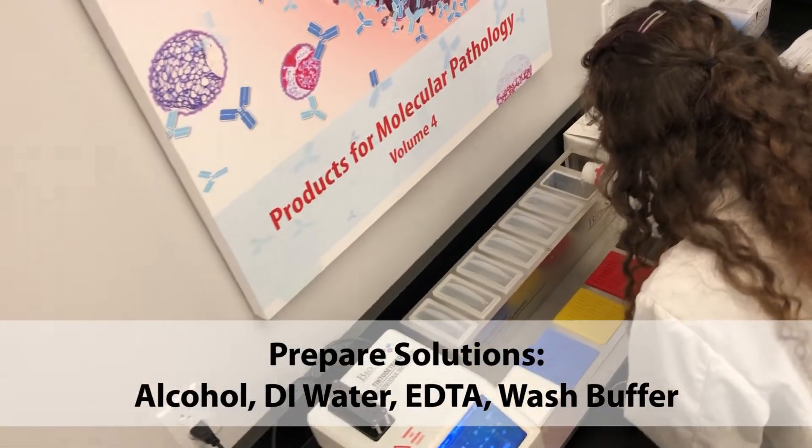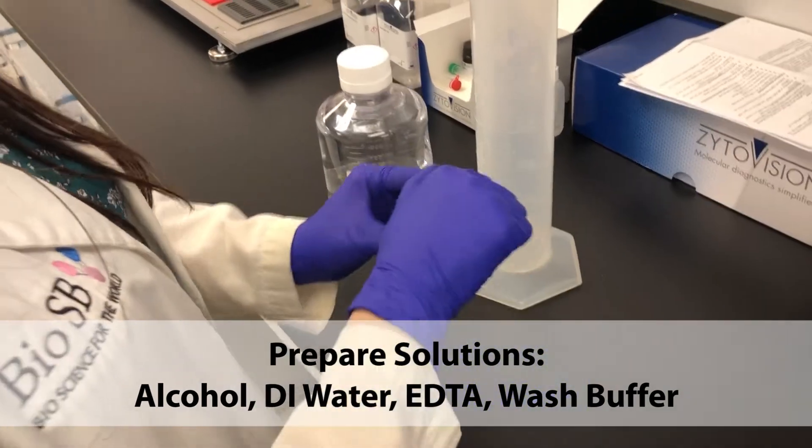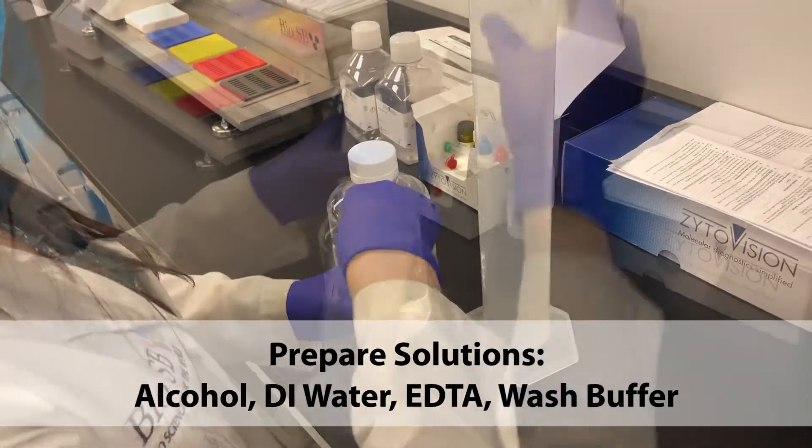As the incubator heats up, we're going to prepare our solutions, including alcohol, DI water, EDTA, and wash buffer.